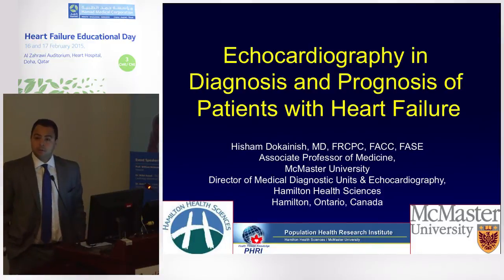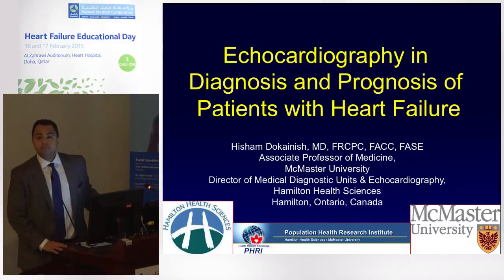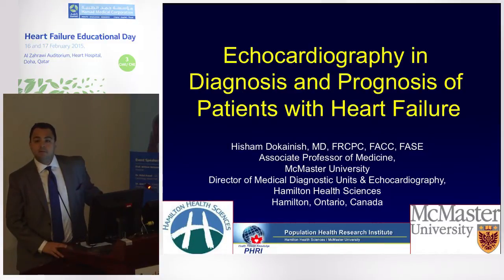Sorry, just on the twisting hypothesis. As you said, when the left ventricle contracts, the direction of twisting is opposite if you go from the base or if you go from the apex, right? So the vectors of movement of the layers at one point in the left ventricle will equal 0. So when you do your measurements, it's really crucial to know where you put your section. Because if you put your section close to the apex and you move downward, your values will go down. At one point, your values will go back up, absolute value. So how do you pick the exact layer or the level when you are measuring your twisting?